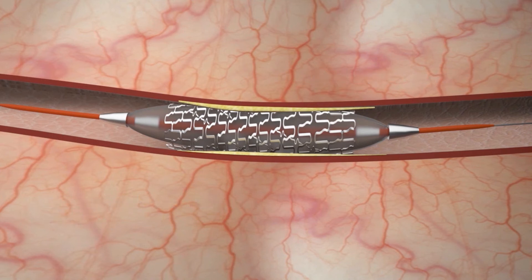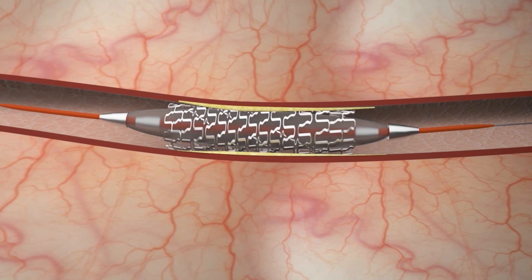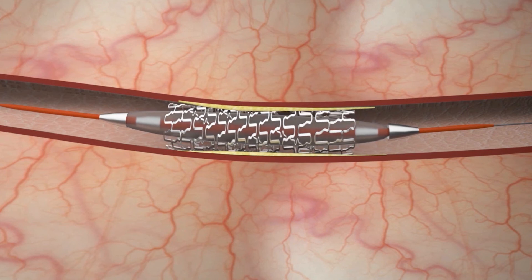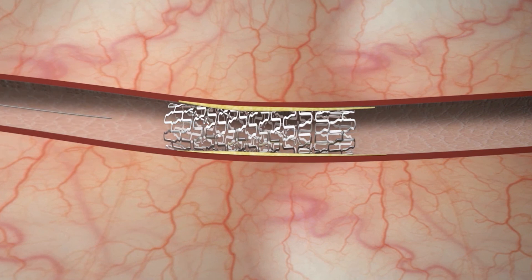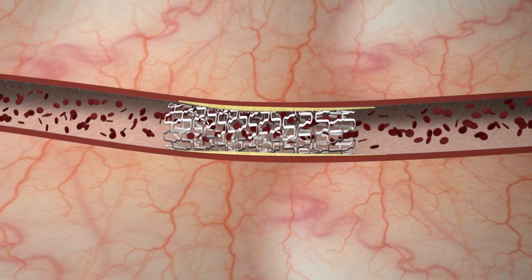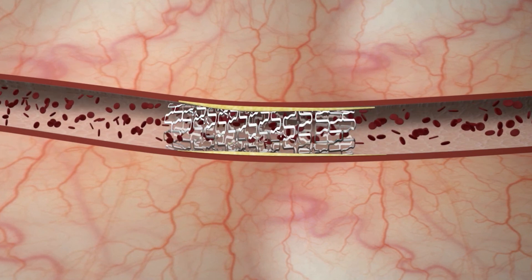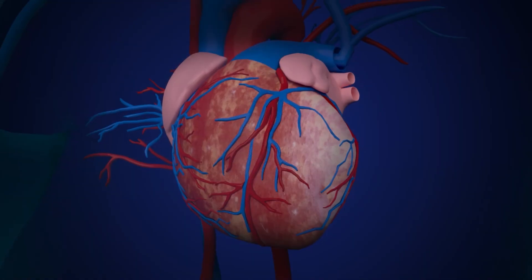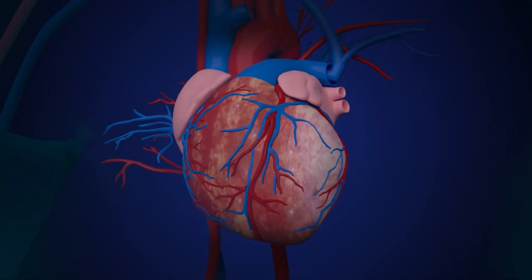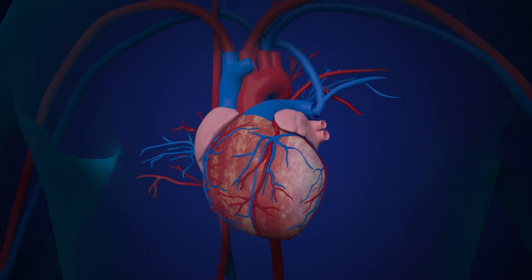Once the plaque is compressed and the artery is open sufficiently, the balloon is deflated and withdrawn. The stent stays in place permanently, holding the vessel open and improving the flow of blood. This completes the angioplasty and stenting procedure.